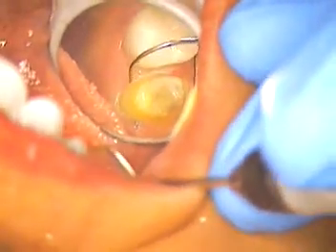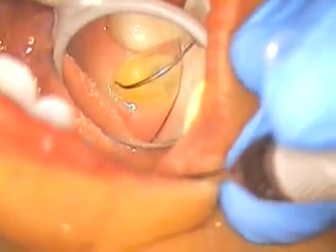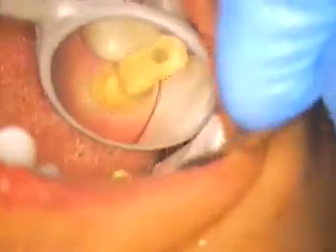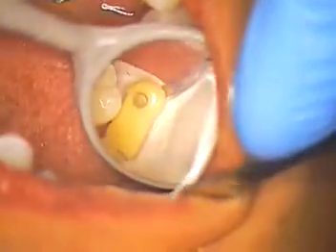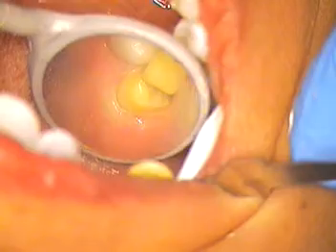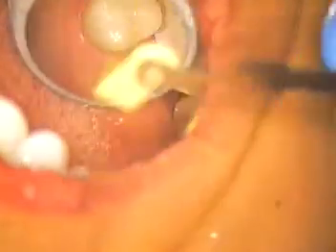Okay. Shade guide. You want the regular shade guide bleach? Yeah, whatever we used last time. That'd be great. There we go. We're gonna use the ND. What did we use last time? ND4? ND3. We'll pull 3 and 4 out and see where we are today. Looks like 4. This one's darker. Okay, you can take a picture of that. Oh, we'll do that after. That's right, I'm not hooked up yet on that. Okay, we'll do that after.